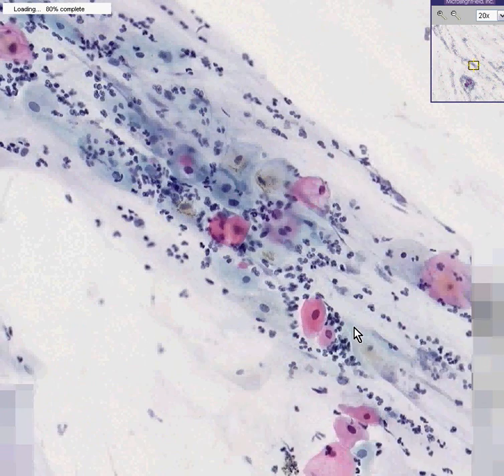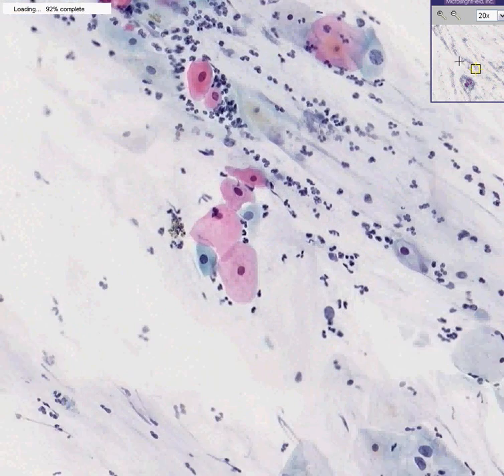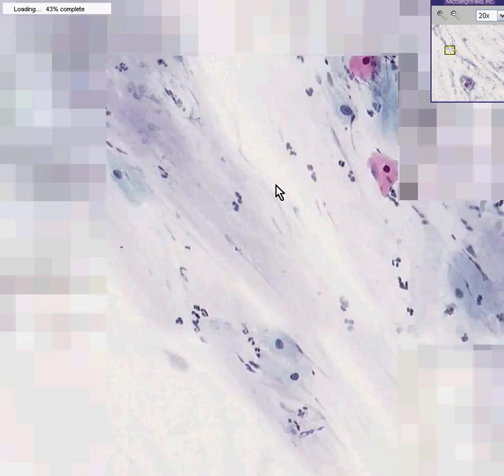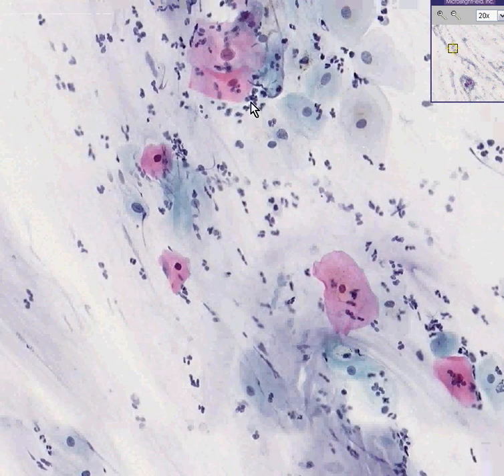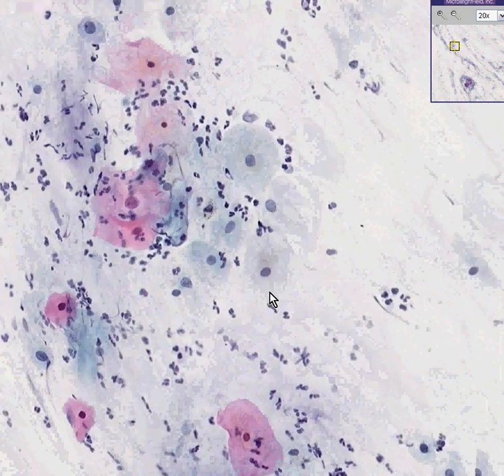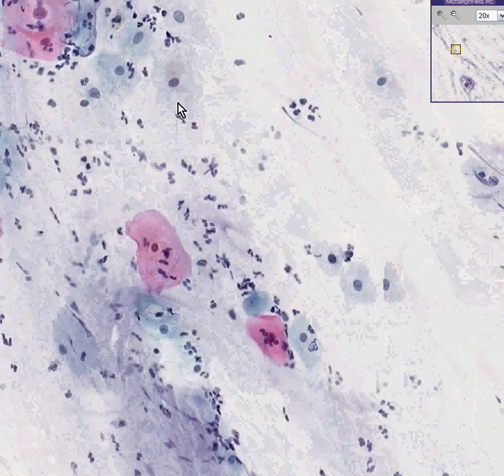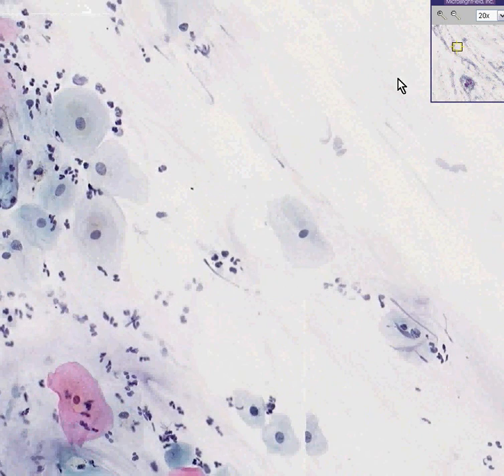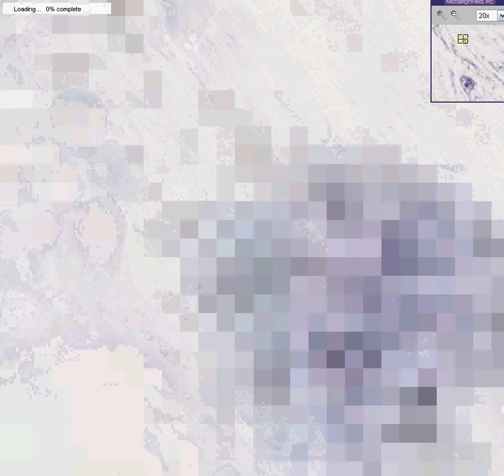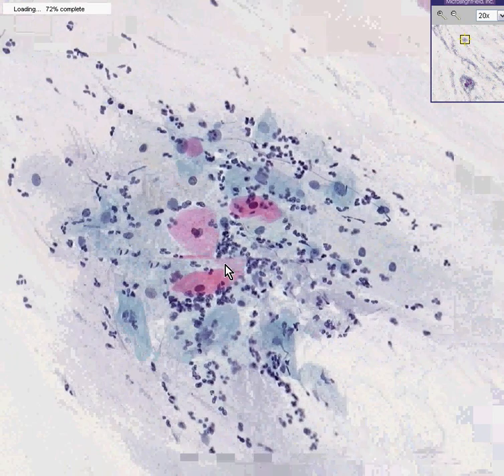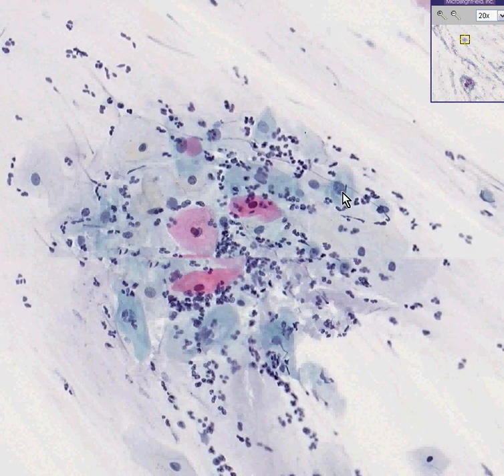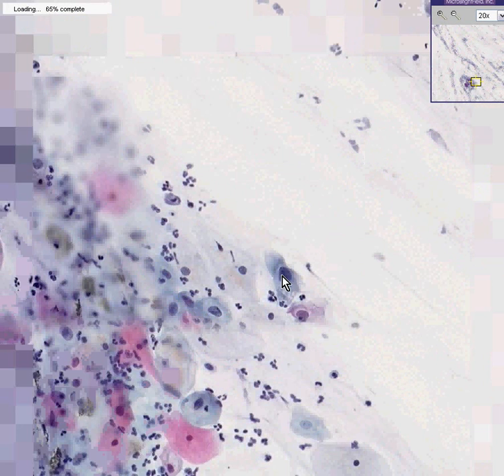And of course, if we have the time to examine a gazillion cells nicely and carefully, we could see that these aberrations are not very numerous, or not very profound. Let's zip over to a couple of other areas. For the most part, they look normal, but then you can see a few little nuclei there which are a little bit darker and bigger than they should be.